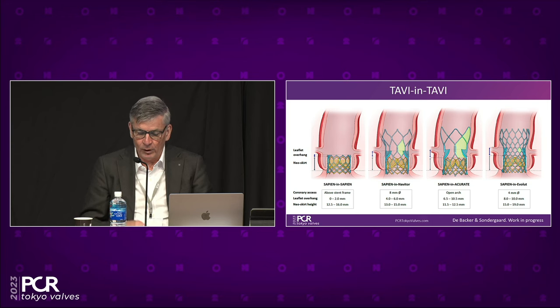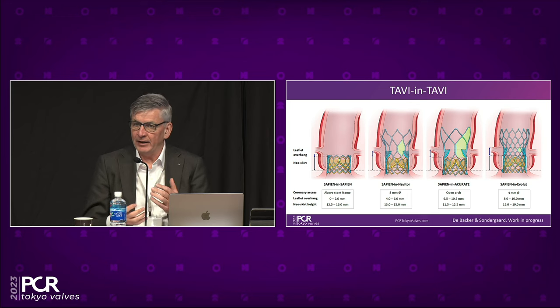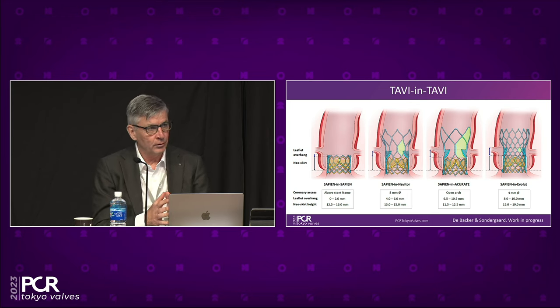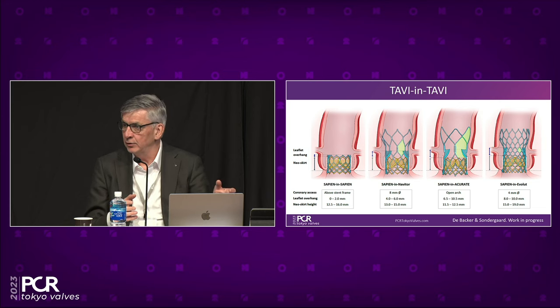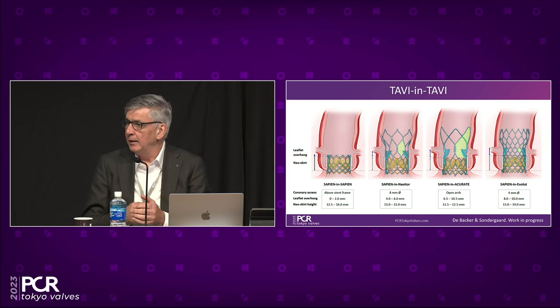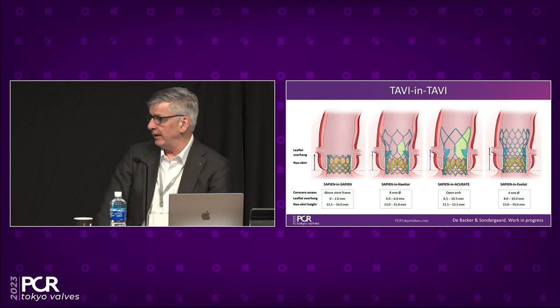So again, if you want to talk about TAVI in these younger patients, talking about lifetime management, we need to think really carefully before we make the decision on the first valve. Should it be a surgical valve? Should it be a transcatheter heart valve? If you want to go for TAVI, which platform is best to have good durability, avoid patient-prosthesis mismatch, but also which valve is at the same time well suited for TAVI in TAVI later on without jeopardizing access to the coronary arteries. So, Kentaro, maybe you can show us how this procedure actually went.